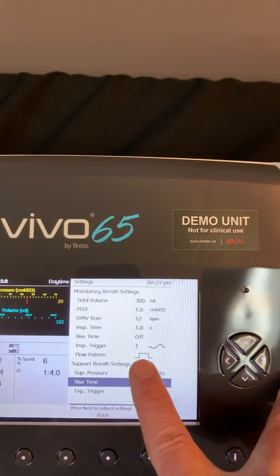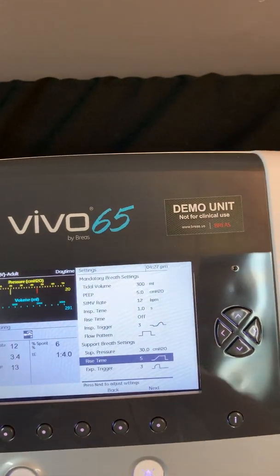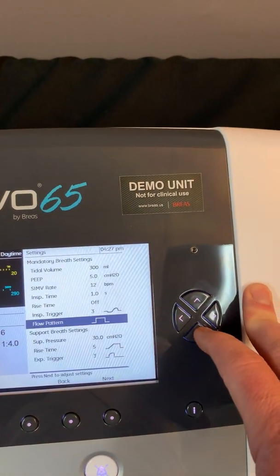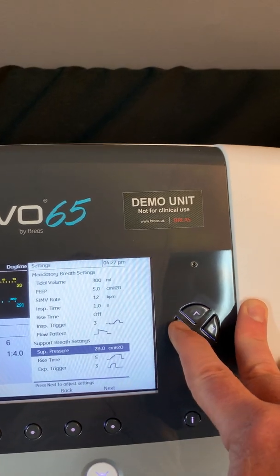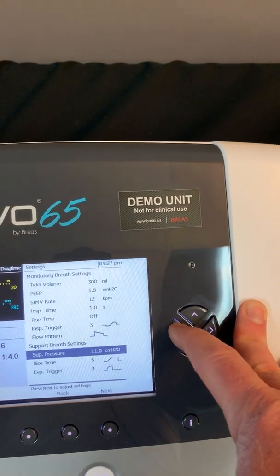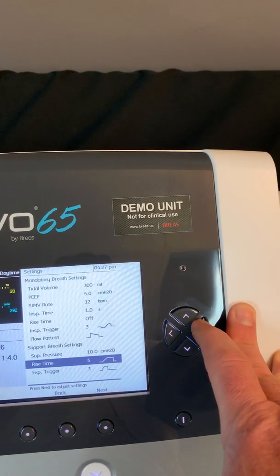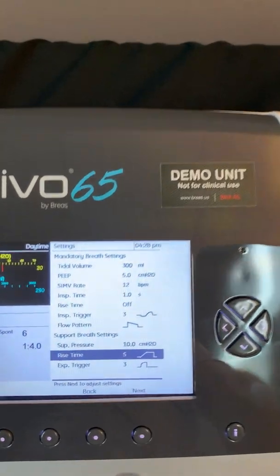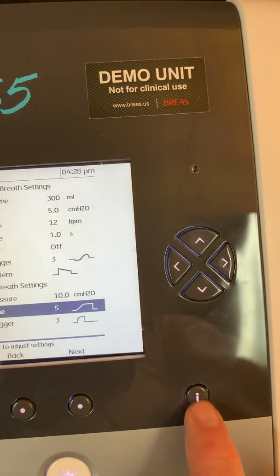My support breath settings include a support pressure, a rise time, as well as an expiratory trigger. If I wanted to make any changes, I'm just going to simply highlight the parameter I want to change. I can change to a descending flow pattern. Maybe we can turn the support pressure down to 10. Let's say I'm a caregiver at the bedside and I'm not entirely sure what rise time means. I've got a little special I button here.